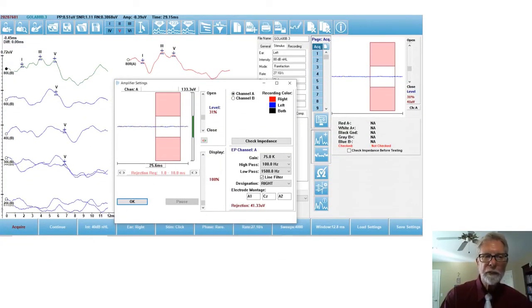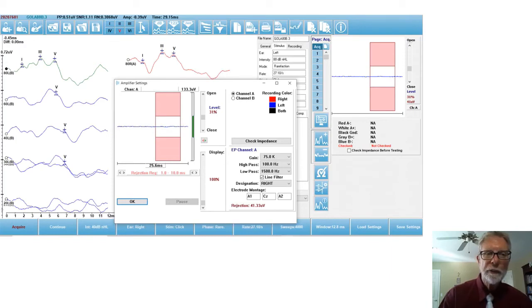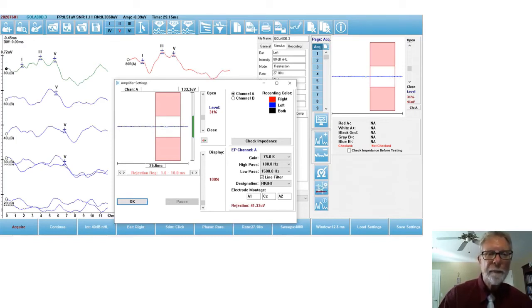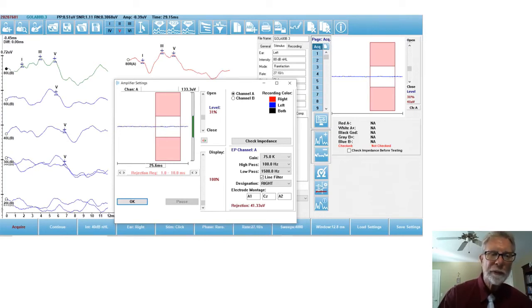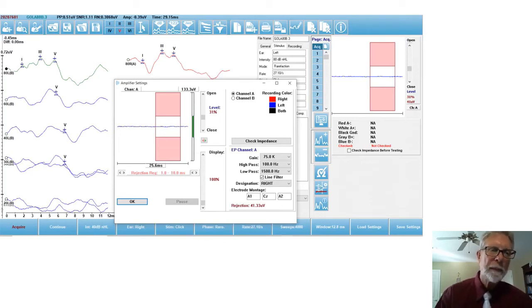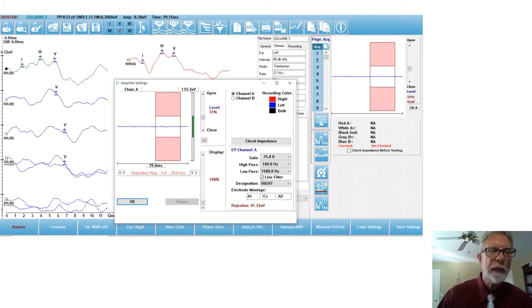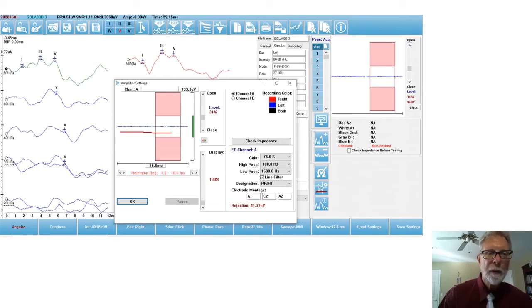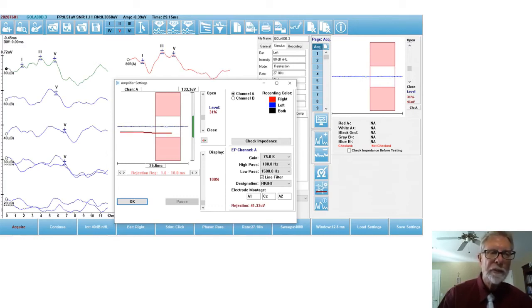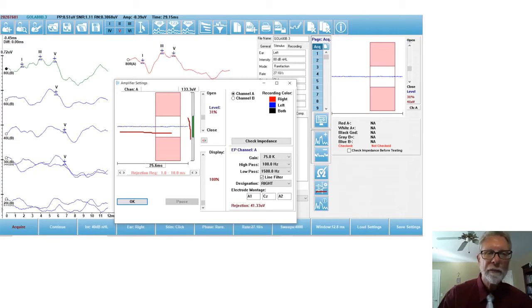This slide is an expansion of the filter icon. When I press this icon right here to be able to access my filters, then this is what pops up and I can move it wherever I want to. And of course, I see my EEG right here live while I'm doing it. And I can adjust the artifact rejection level if I want to.